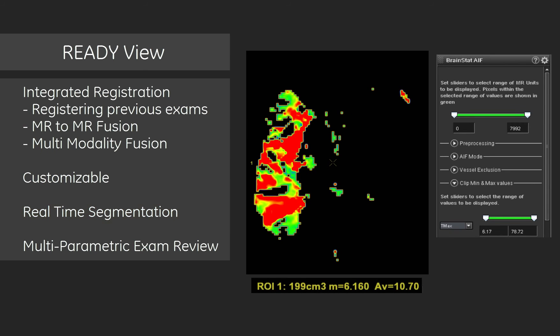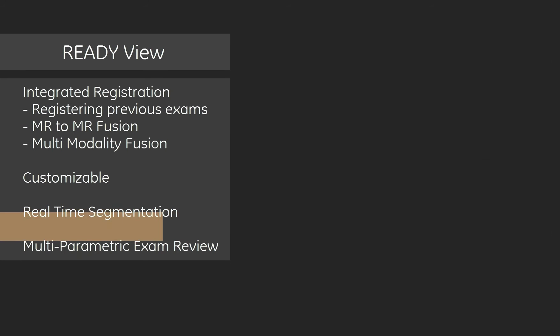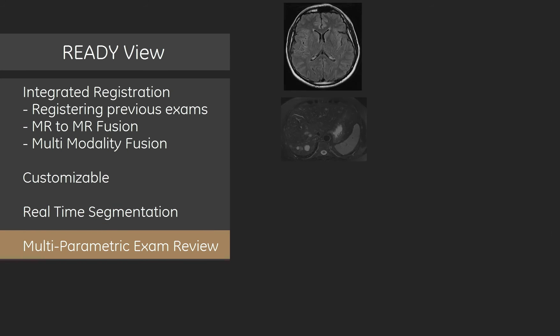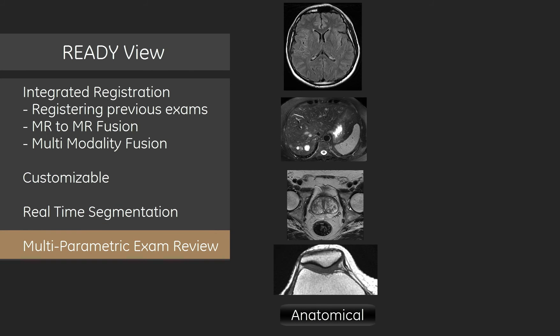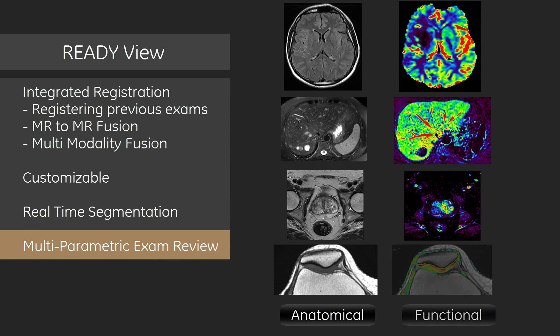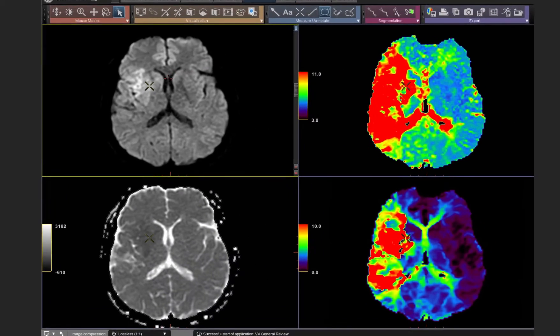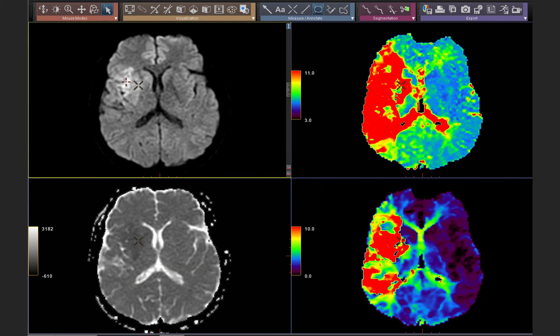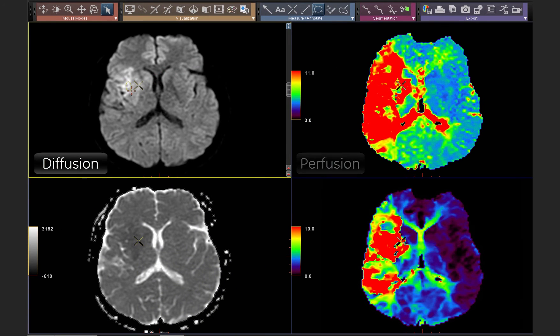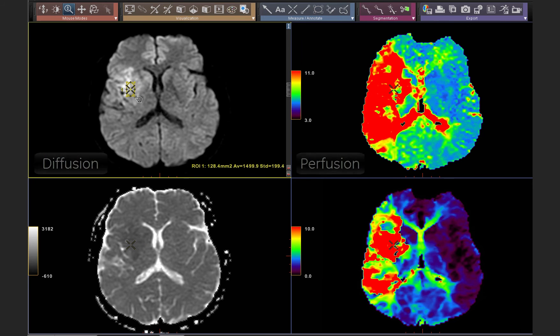The ability to review multiple datasets all in one tool allows accurate and efficient analysis of anatomical and functional data. For example, it is not uncommon for an exam to include both the diffusion and perfusion dataset. This type of review is commonly known as multi-parametric exam review.